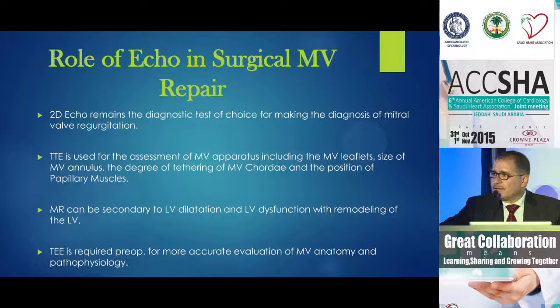look at all the anatomy and the problems of the valve, starting from the left atrium into the mitral annulus, leaflets, the chordae, even sometimes the papillary muscle. And definitely this has been a major help in patients who underwent mitral valve repair in particular.